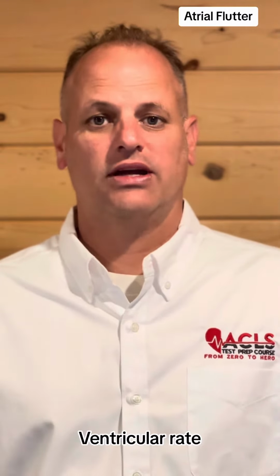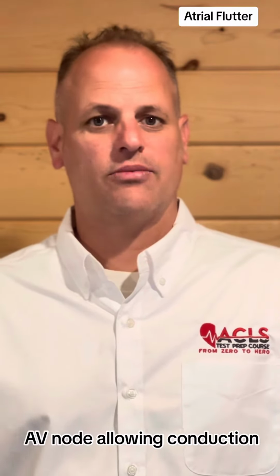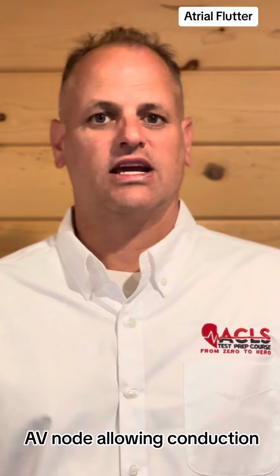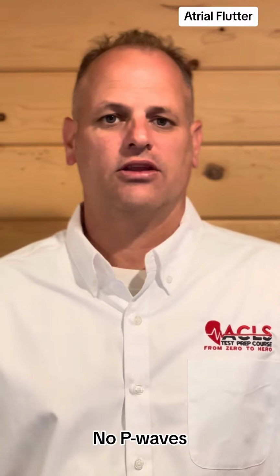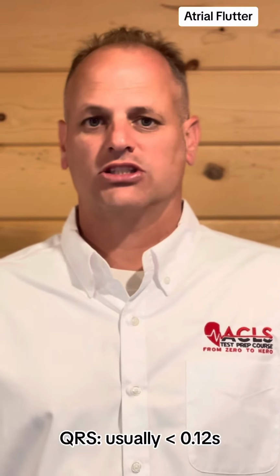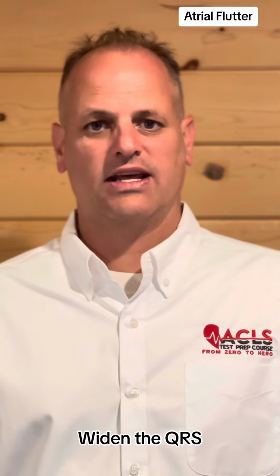The ventricular rate is going to be due to the gatekeeper, right? So how many times is the AV node allowing this conduction to occur? That's going to be your ventricular rate. The P waves, there are no P waves, there are flutter waves or F waves. The PR interval, there is none. QRS complex, generally narrow unless there's some aberrancy, which is going to widen that QRS.